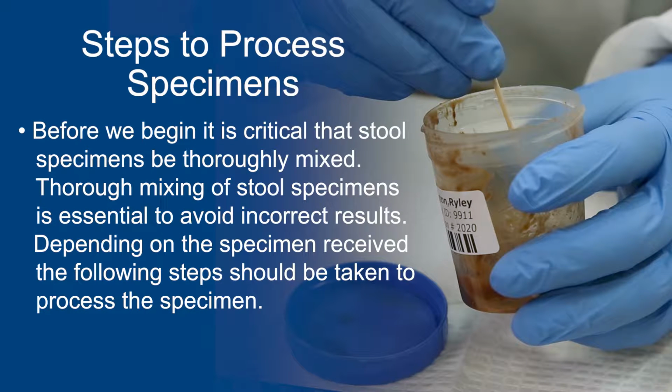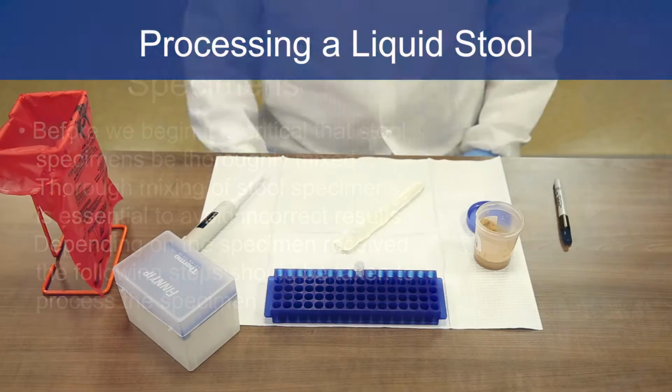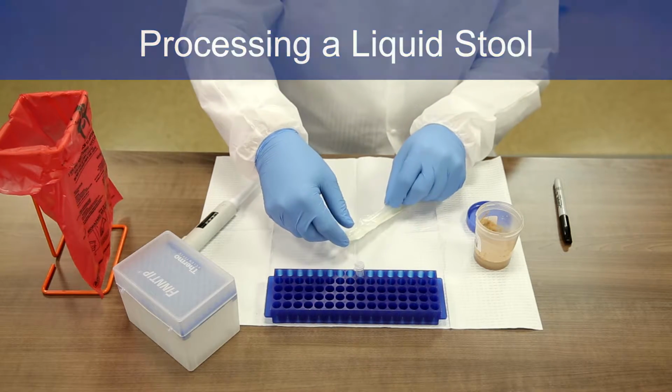Before we begin, it is critical that stool specimens be thoroughly mixed. Thorough mixing of stool specimens is essential to avoid incorrect results. Depending on the specimen received, the following steps should be taken to process the specimen. Let's begin with processing a liquid stool.